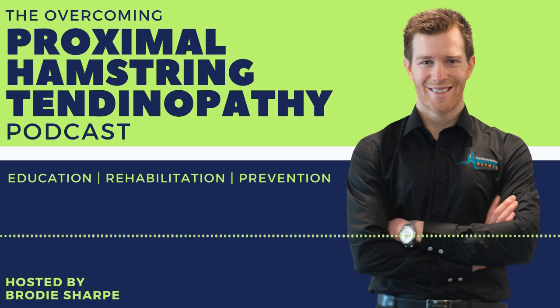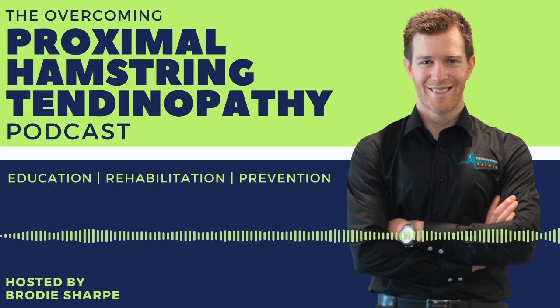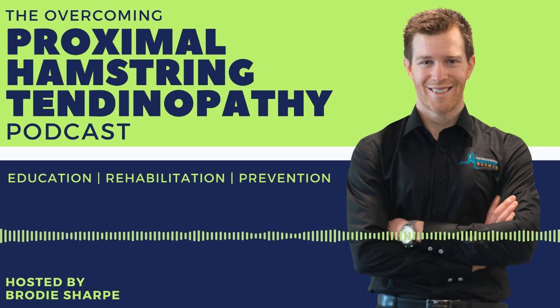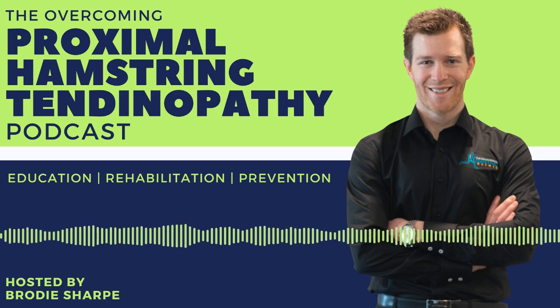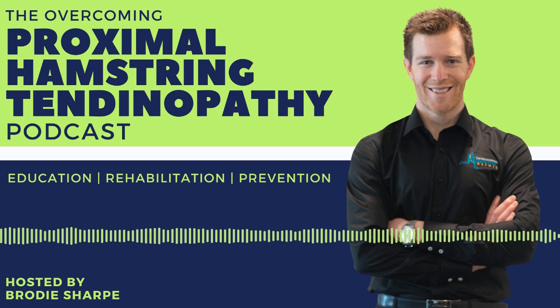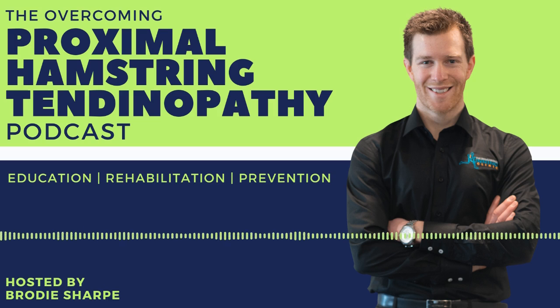So it's, again, picking the right tool based on your clinical findings. And a lot of times I'm seeing Shockwave used as a massage tool everywhere. It's a very powerful tool, but again, you need to pick your patient. So as long as they're stable, they're chronic, and they're willing to do the rehabilitation, then you might have good success. If you're going to throw it on anyone, I get a lot of patients who are disappointed once they buy the machine because they think it's going to fix everything, because the human body is more complex than that.